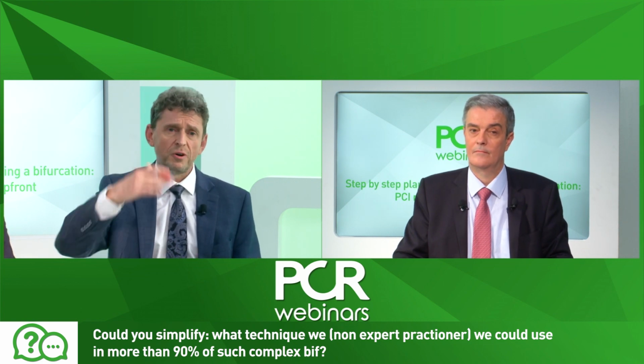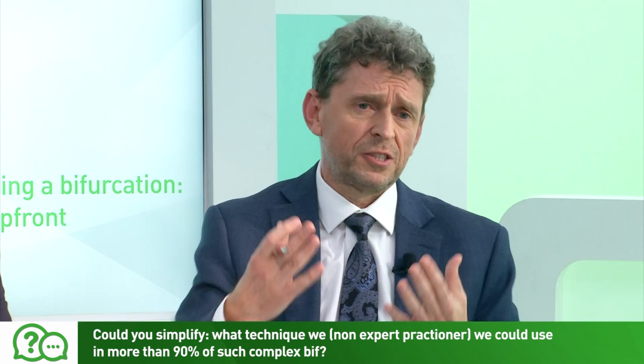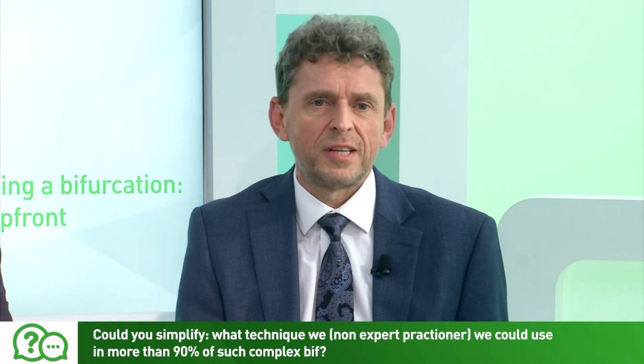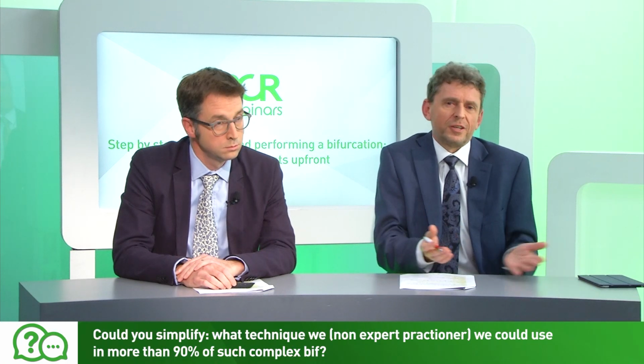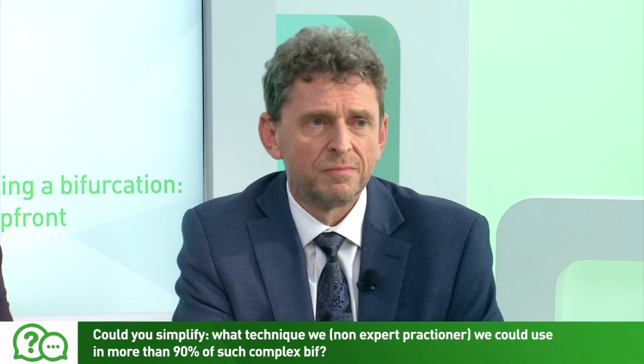Then of course if you go a higher level, but anyway, I practice in most of these cases DK crush, and I feel I'm best in DK crush, which does not mean that I cannot do culotte, but I'm not that expert in culotte, since in most of my time, I do DK crush. You do DK crush, yeah.